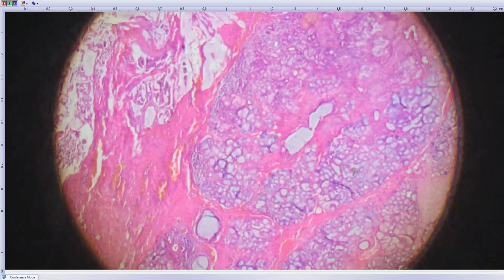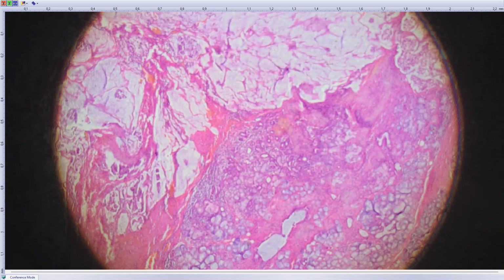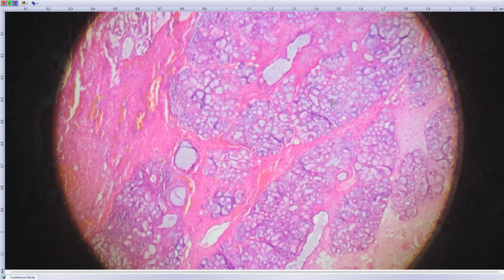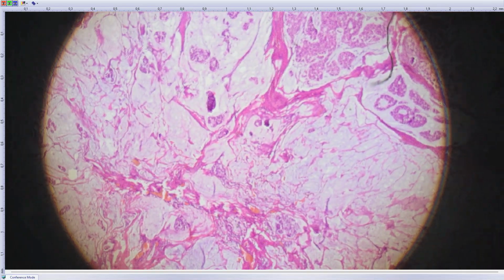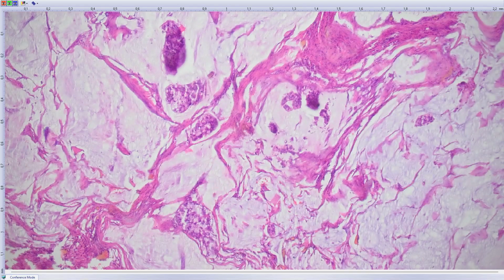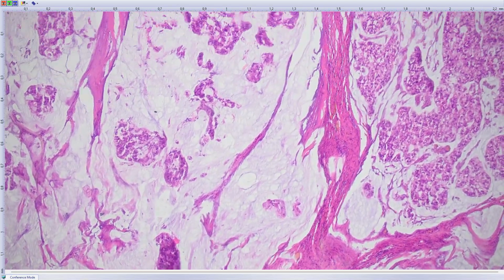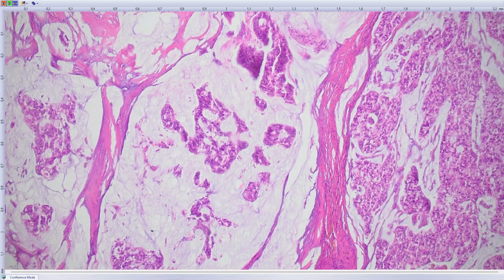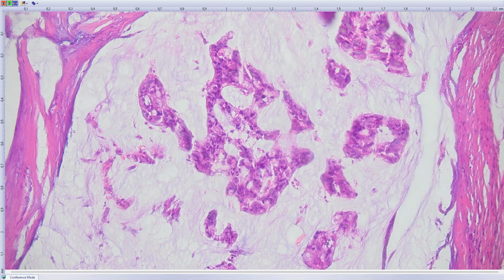You see here a small oral salivary gland with such mucinous proliferation that looks indistinguishable from, for example, metastatic mucinous carcinoma of stomach. And you should not forget about this new entity, which is primary in salivary gland.